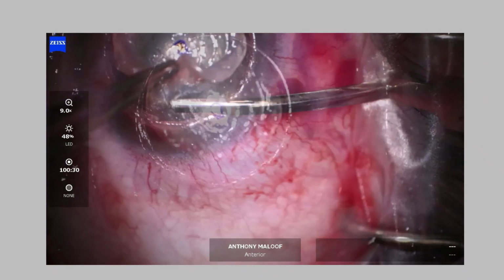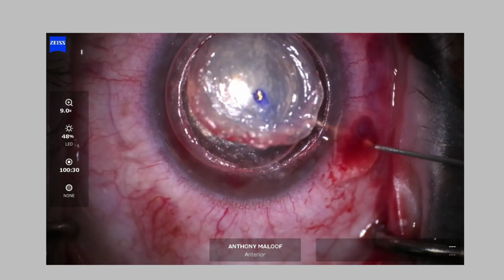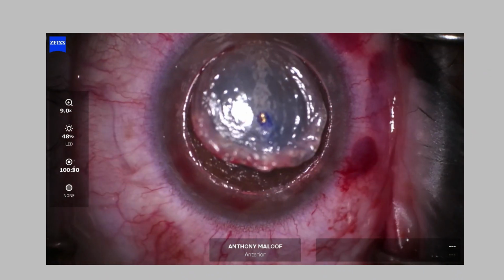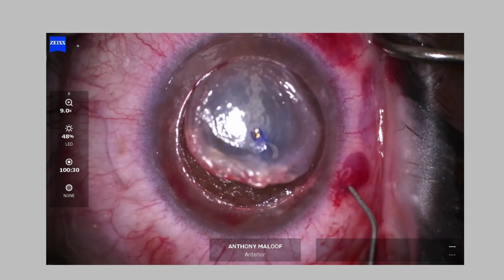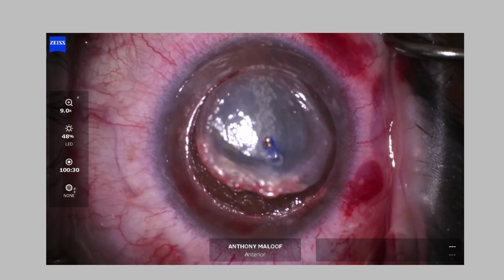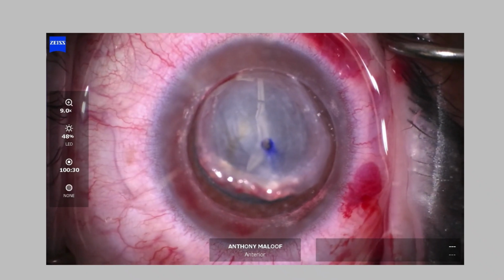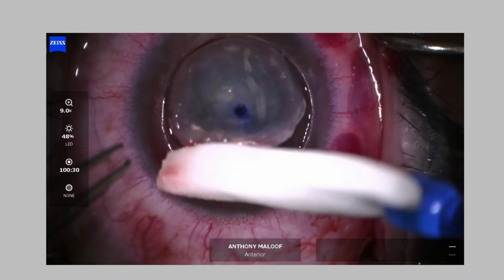Now, if you leave a little bit of stroma in the periphery, so what? It's not granular dystrophy where recurrences can occur. Notice I'm now giving the endothelium a drink again. It's time for the endothelium to have another drink. Please note this is playing at 1.5 speed, so I don't bore you with waiting. But it's not double speed, it's 1.5.